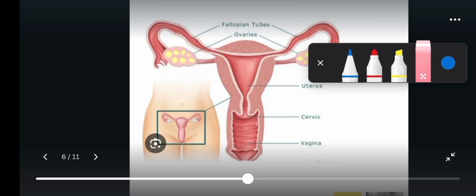Then after that, we use the speculum to open. Then after that, we use the tissue forceps to grip the anterior lip. What we are seeing here is the posterior lip. This tissue here is the posterior lip. So this is a diagram. So the anterior lip is supposed to be at the anterior aspect, that is the surface. So we use the tissue holding forceps to hold it, to grip it.